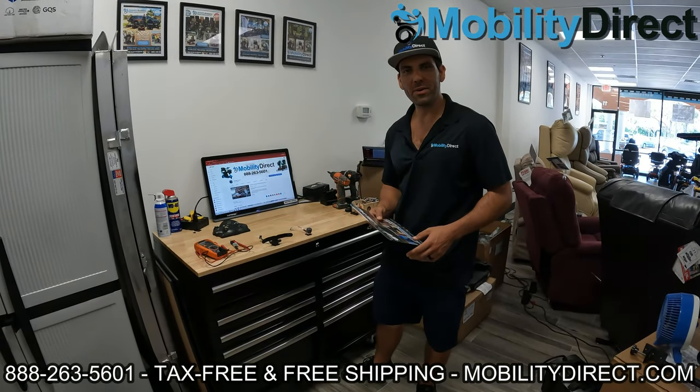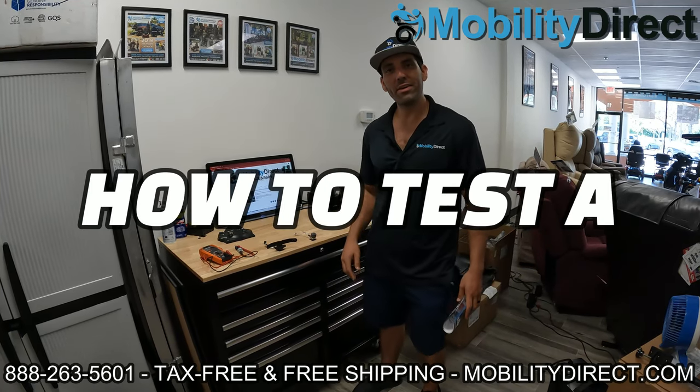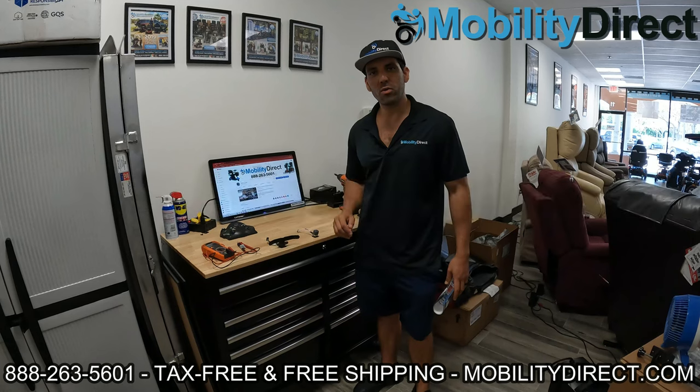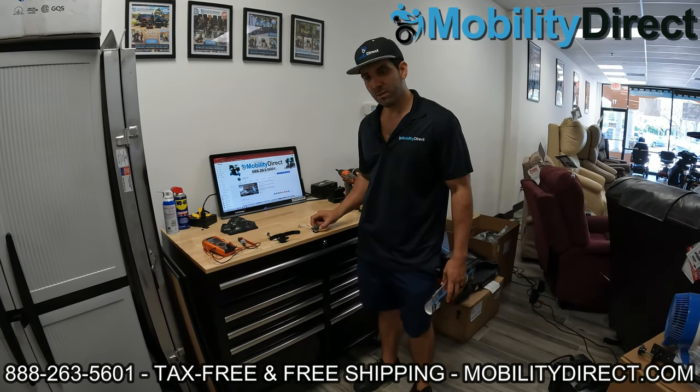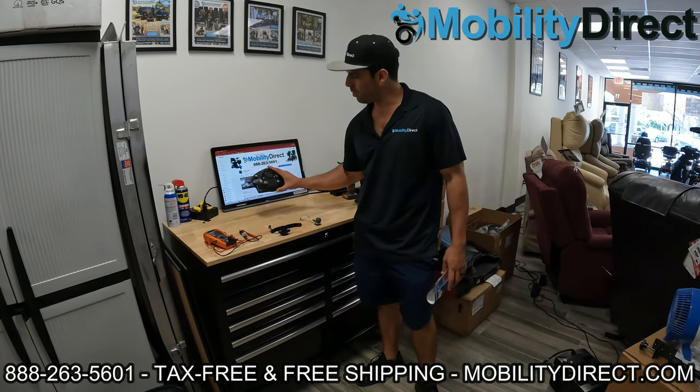Hi everybody, I'm Sergio with Mobility Direct. Thank you for joining our YouTube channel. In today's video, we're going to show you how to test potentiometers on your mobility scooter to make sure that they're working properly. We have a speed potentiometer, speed control knob, and a throttle potentiometer that I took off of a go-go scooter.